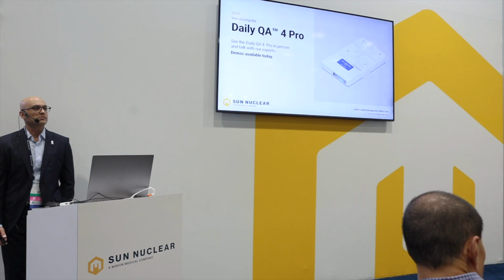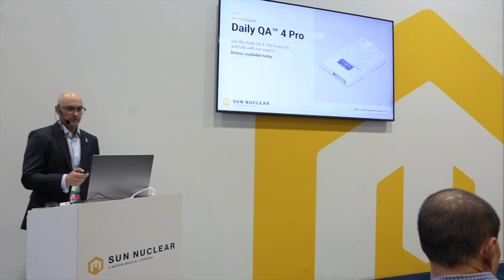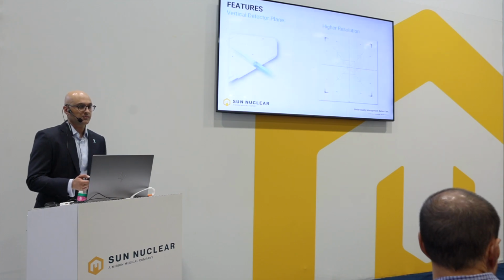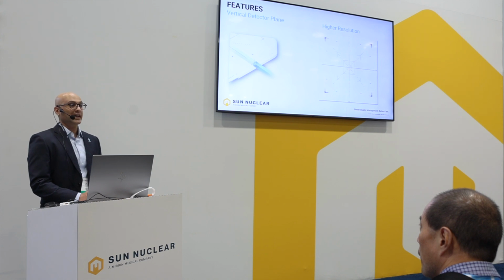Here, hang on. Vertical side. On the side, what's the diode or chambers? What do you have on the side? And what is the resolution? 2.5 millimeters, and they're all diodes.